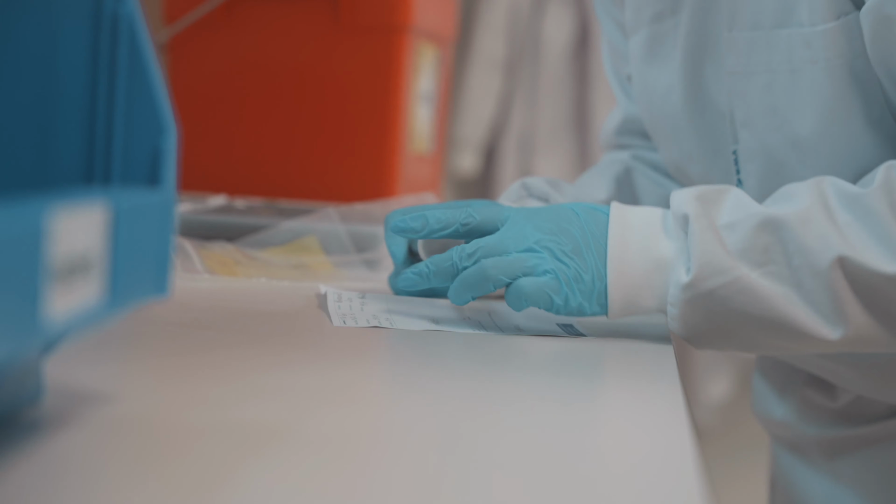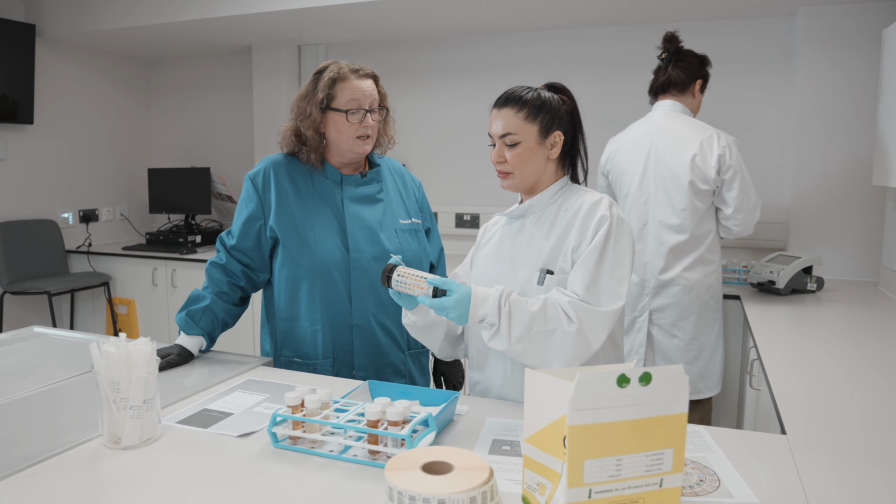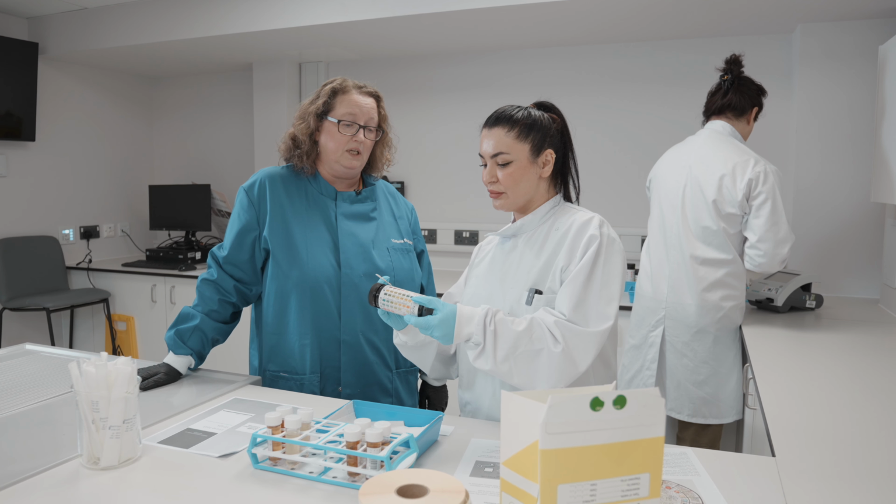There's also a small case study on a diabetic patient where we'll be testing this patient's urine to determine whether they might have diabetes or not. Covering all of the pads with urine, then drag it across the side of the tube to remove all of the excess. That's it. So if we start at the bottom, so this one here is glucose. It's negative, there's no glucose in that particular sample.